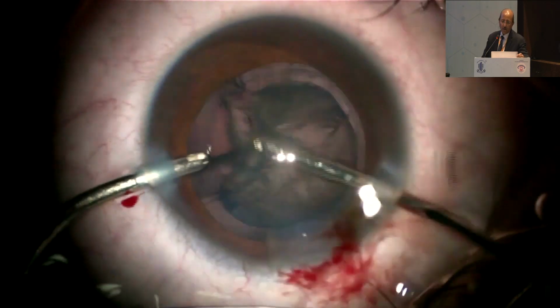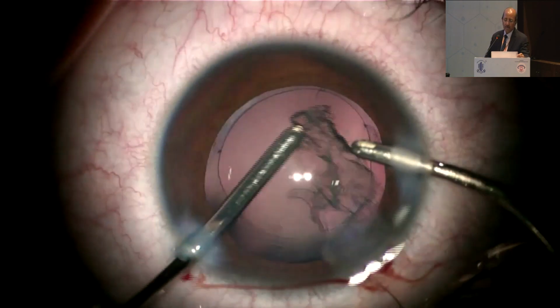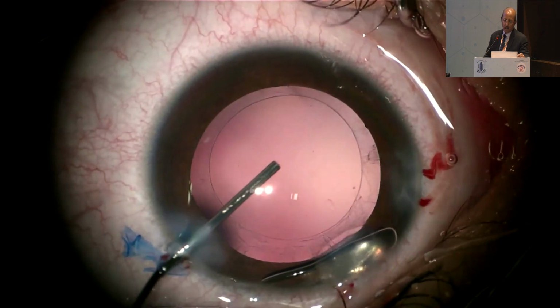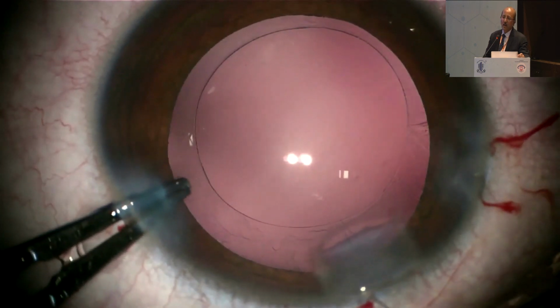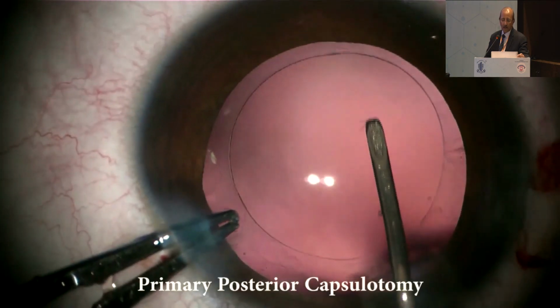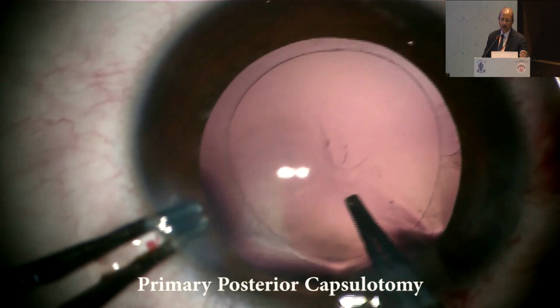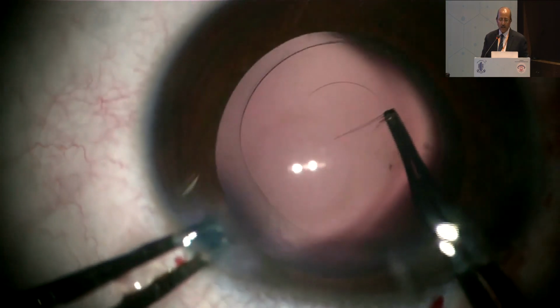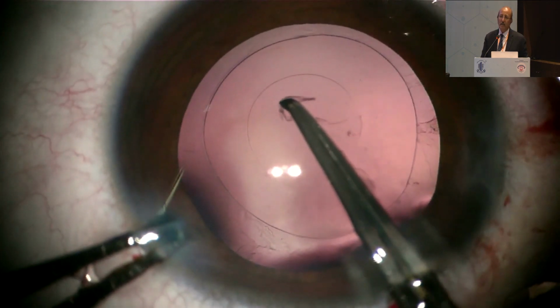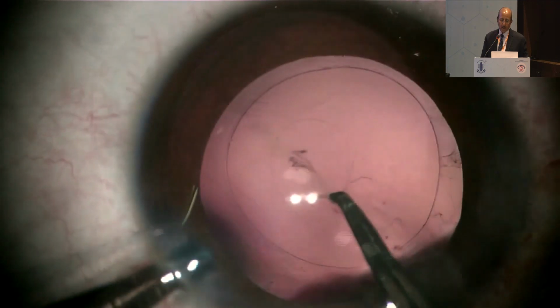Hydrodissection is followed by removal of the cortex from the capsular bag, and then usually in children less than 6 years, sometimes even less than 8 years, we make a primary posterior capsulotomy. The size of the primary posterior capsulotomy is kept around 3 to 3.5 millimeters. If you make it very large, it will be difficult for you to place the IOL.